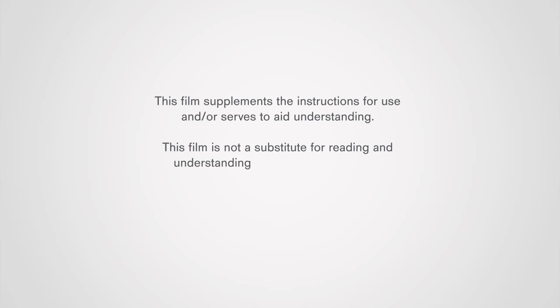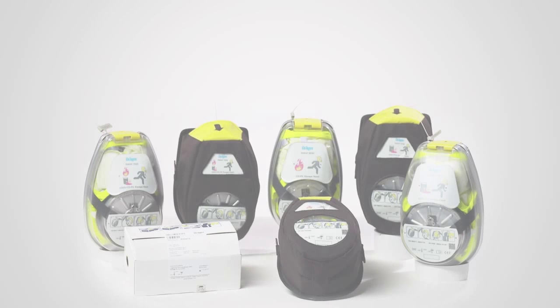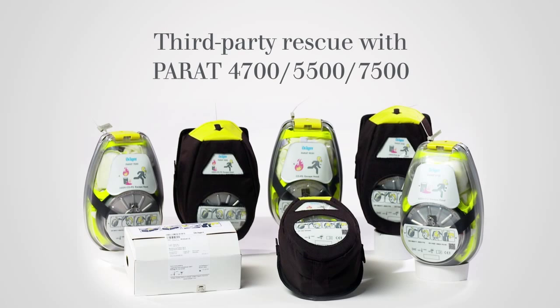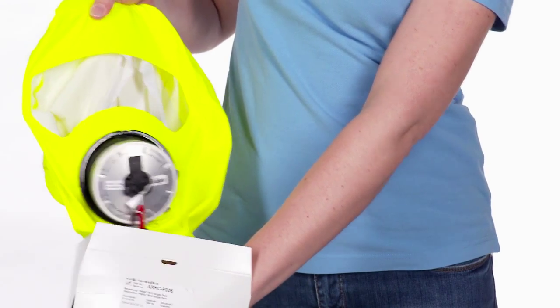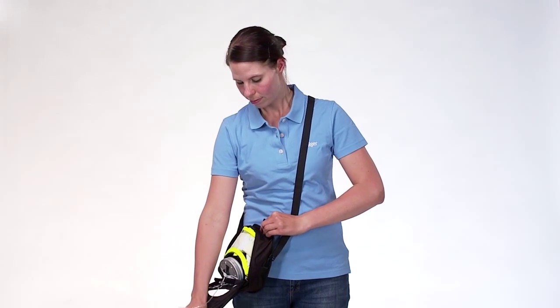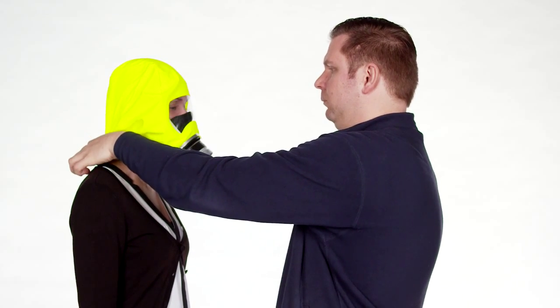This film supplements the instructions for use and serves to aid understanding. This film is not a substitute for reading and understanding the instructions for use, nor is it a replacement for mandatory instructions or training courses. We will now show you how to open the different Draeger Parat packaging types and how to put the Parat hood on a third person for rescue purposes.